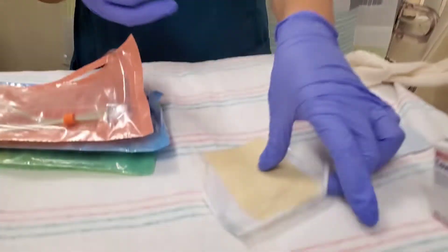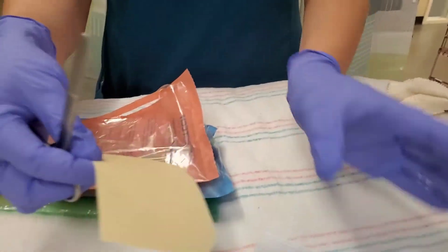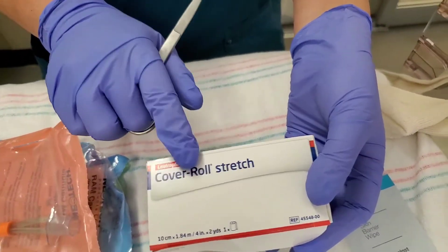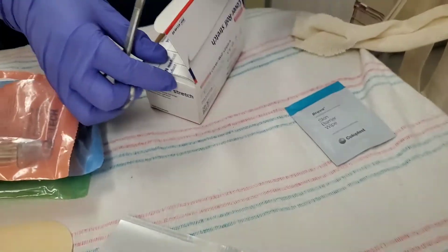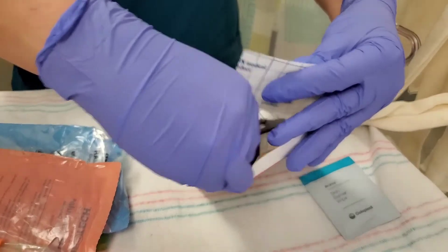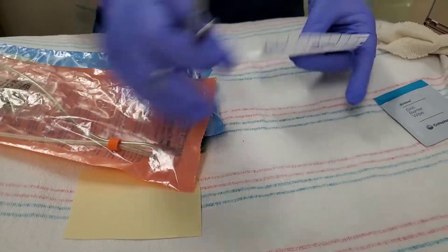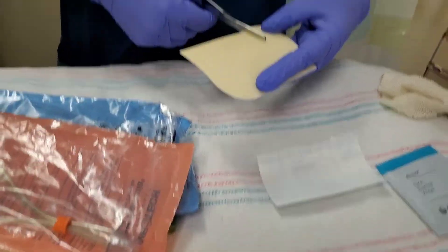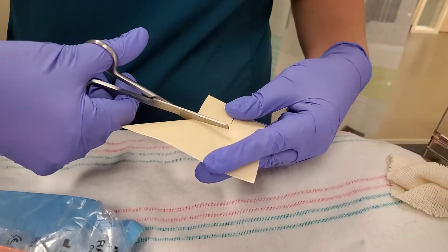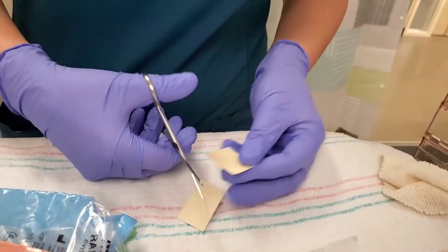First of all, we want to cut our cheek tapes. This Replicare Thin, which is like Duoderm, we're going to use that as our base for the cheek tape. This is what secures the RAM cannula to the Duoderm. This is just white cloth tape. You can cut these in any shape that you like, but the idea is to cover enough surface area of the cheek without getting in the baby's eyes or on the lips.